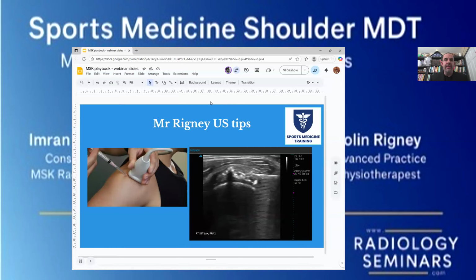So we talked about the calcific tendinopathy and some treatment approaches. A lot of my role, what I do professionally, is I work as a consultant with a number of physicians in my city who are in our education program, our residency program. And we teach guided techniques with ultrasound, what to do with the findings, right? And so what we're seeing here is one particular injection approach. We encourage you to be able to do multiple approaches.